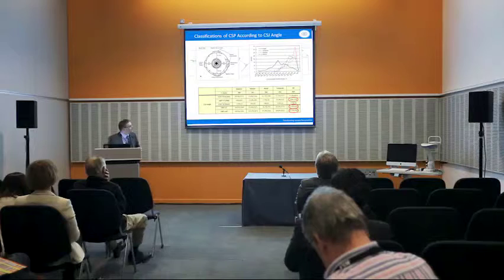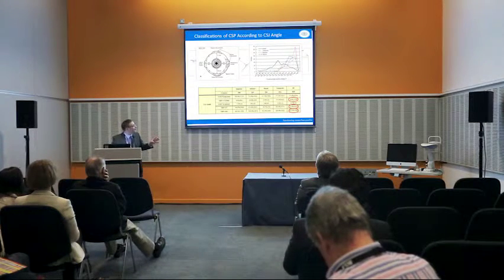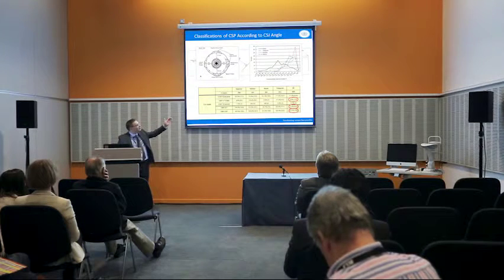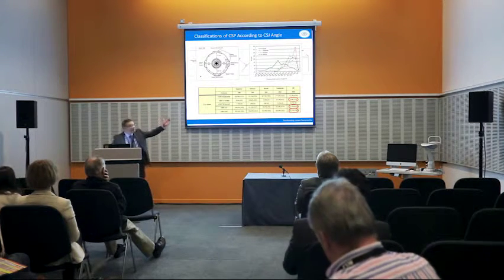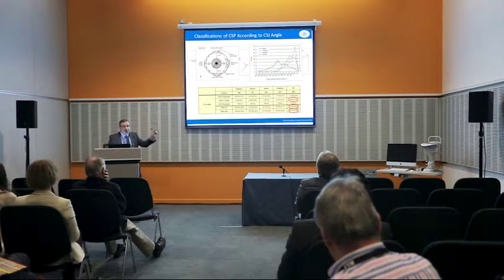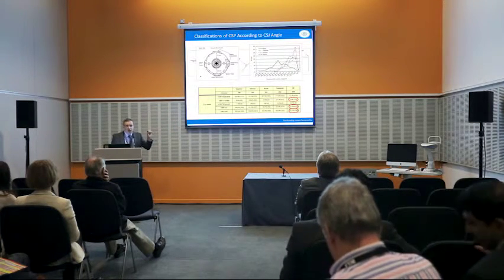Now, looking at those 408 eyes, it looks rather complicated, that graph, but if you just break it into superior, inferior, nasal, and temporal, and then look at the total, what was really interesting was that in 22% of cases, so almost a quarter of all of the angles around the eye, were within 1 degree of 180.